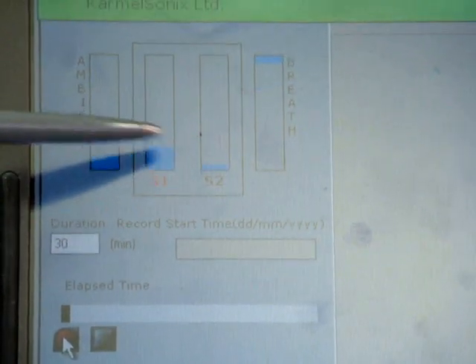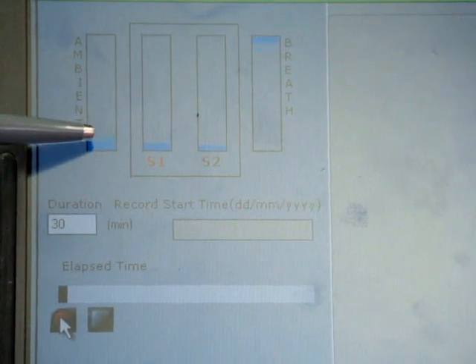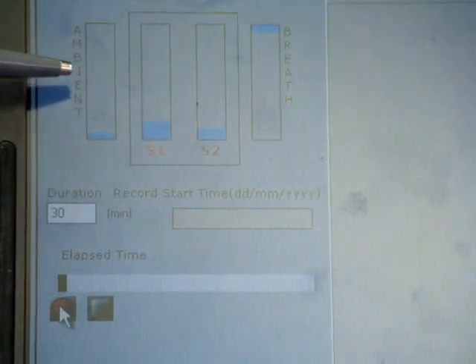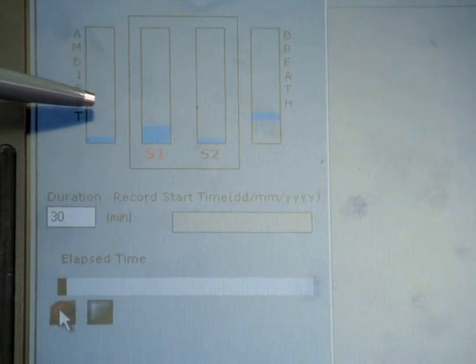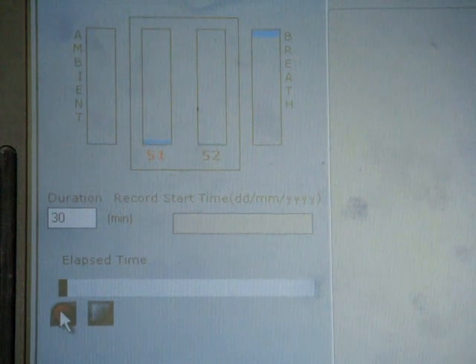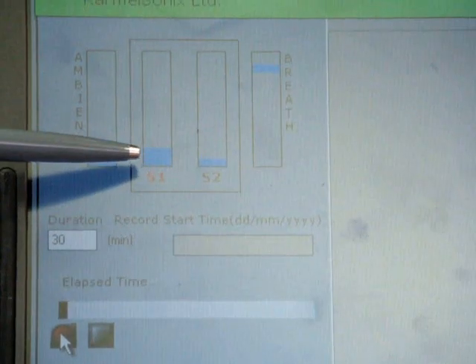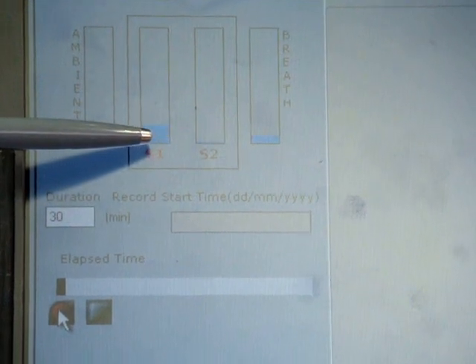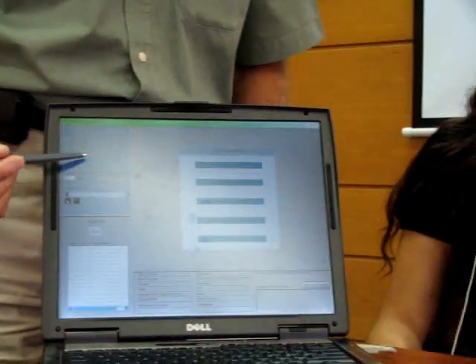I can see that both sensors are moving. This bar here shows the volume of sound from the ambient microphone, which is situated in the pod. It's showing a lot of ambient noise because I'm talking at the moment; if I stop talking, you'll see that the ambient sound is very quiet. I'm now going to ask our volunteer to take a couple of deep breaths so you can see how the signal moves. Take a couple of deep breaths, please — inspiration and expiration. This is the tracheal sensor and the chest sensor.